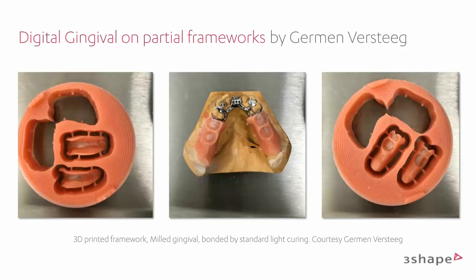And of course, he then milled the teeth and put them in, or you could also use pre-manufactured teeth. But really a nice workflow that solves the basic problem of connecting, in a pragmatic way, the gingiva with the actual frame and the retention grid, and gets that retention that we are all looking for. Yeah, that's a really cool workflow, and I have a couple of other people also adapting that, like John Batchelor and others from New Zealand, and there's really good feedback on it.